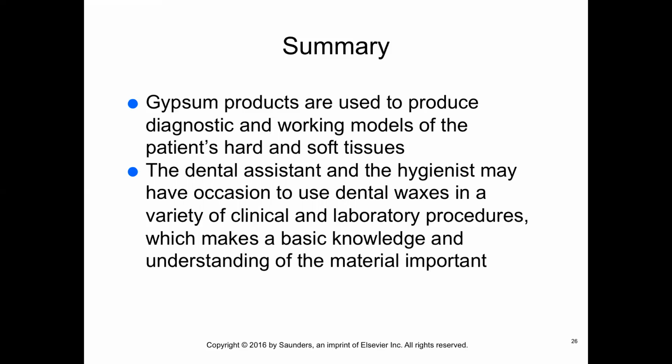You will help the dentist out. A lot of times after he comes in and does the exam, he may say, oh, let's make some whitening trays, and the patient agrees to it. So if you have time, you're doing the dentist a favor by taking those impressions and being able to pour those models as well. Plus the assistants will like it even better.